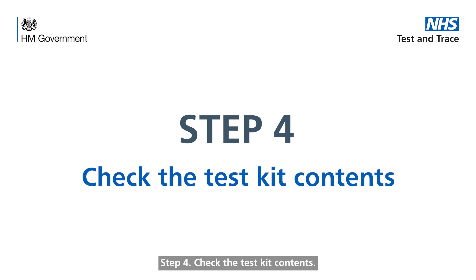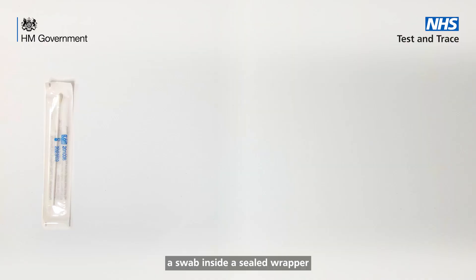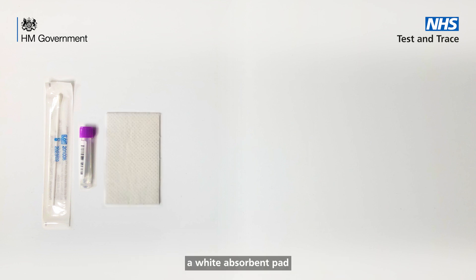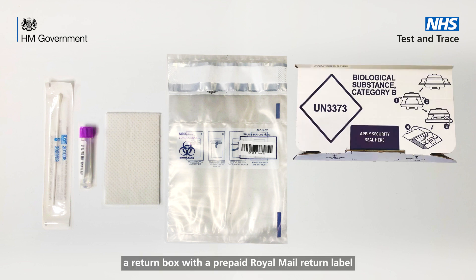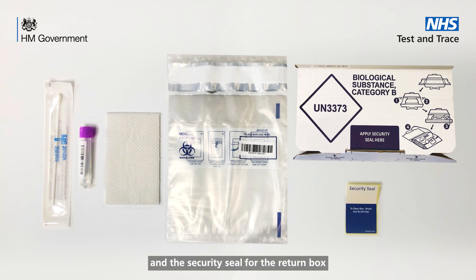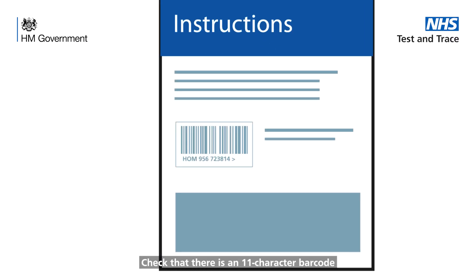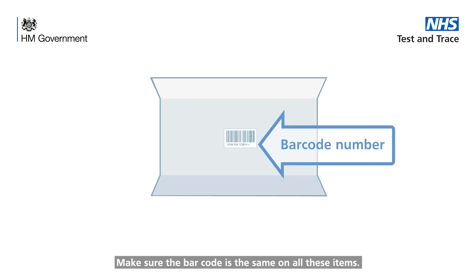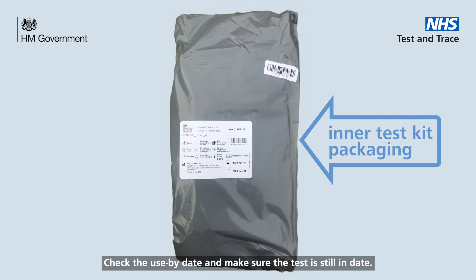Step 4. Check the test kit contents. Make sure your kit contains the following items: a swab inside a sealed wrapper, a plastic tube containing a small amount of liquid, a white absorbent pad, a leak proof bag, a return box with a prepaid Royal Mail return label, and a security seal for the return box. Don't worry if some of the items don't look exactly the same as shown in this video. Check that there is an 11 character barcode on the instruction booklet, plastic tube, leak proof bag and return box, and make sure the barcode is the same on all these items.